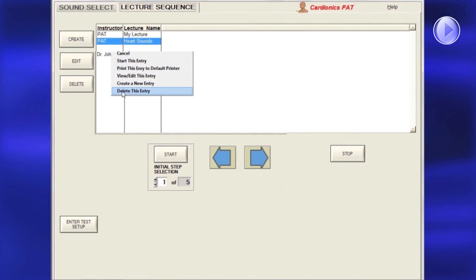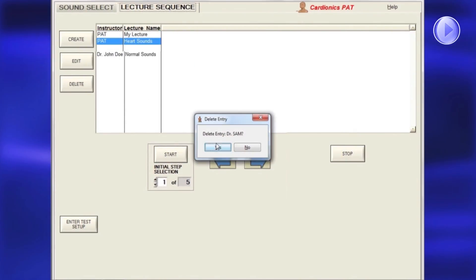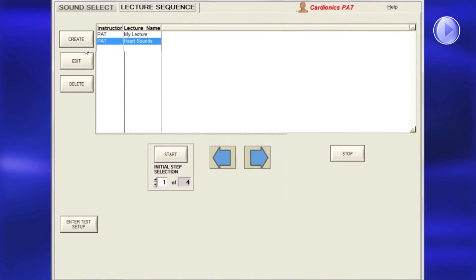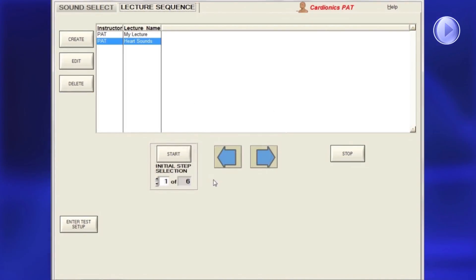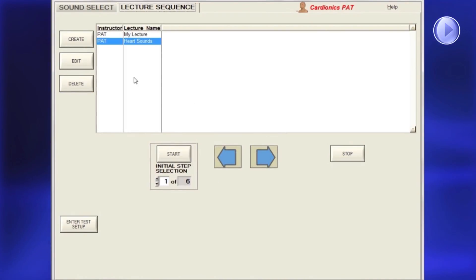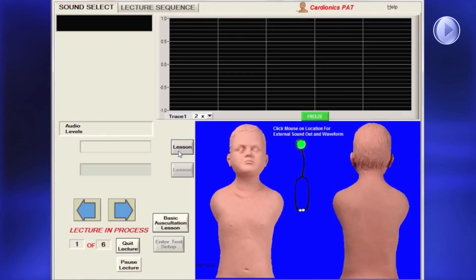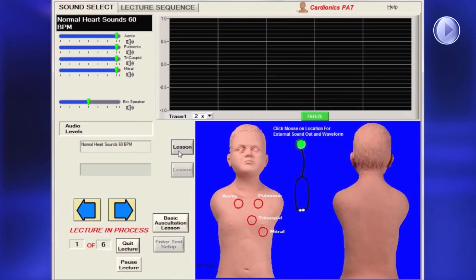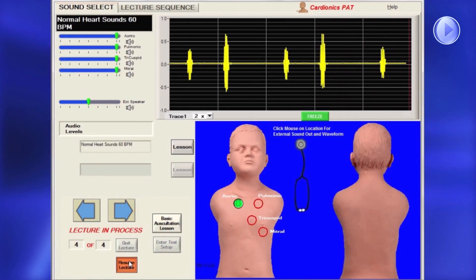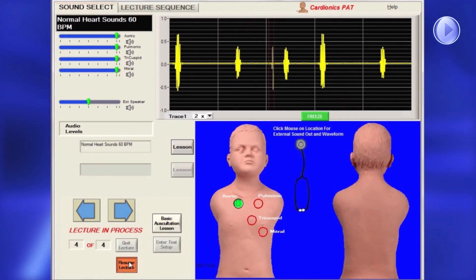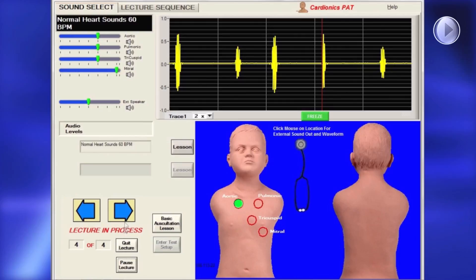To delete a lecture entry, right-click the mouse or select Delete. To begin using your lecture immediately, click Start. You may pause or quit a lecture at any time by clicking Pause or Quit.